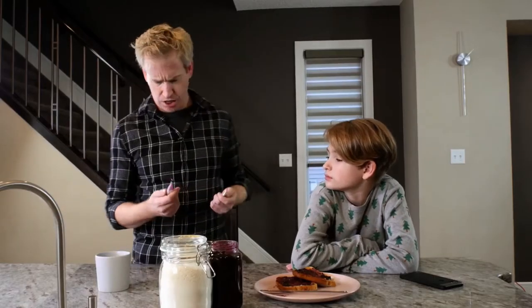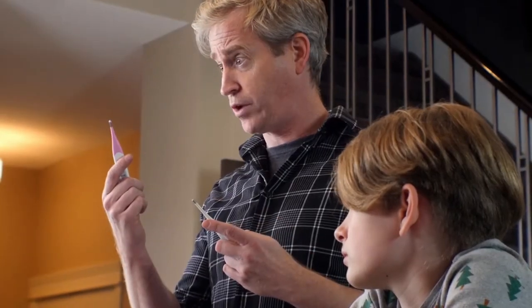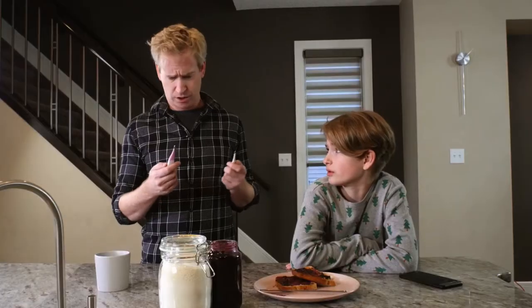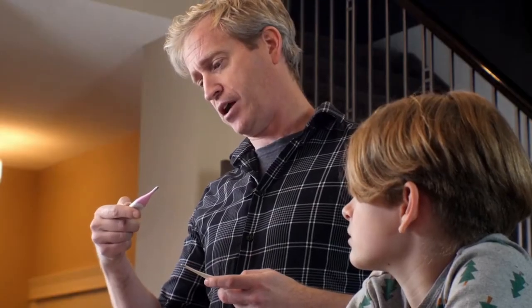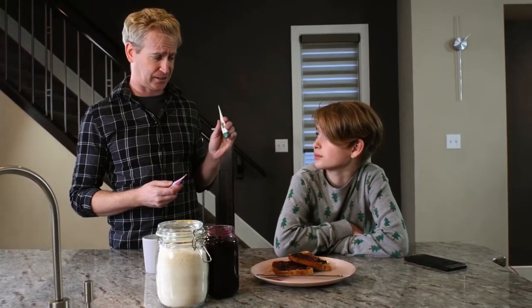Okay, champ. I'm going to take your temperature. I just have to remember which one of these we use for oral and which one for rectal. If you can't remember that, I'm not putting either of those in my mouth. Hold on. I'm pretty sure it's this one. But the battery's dead. So I guess that means we got to do it the other way.